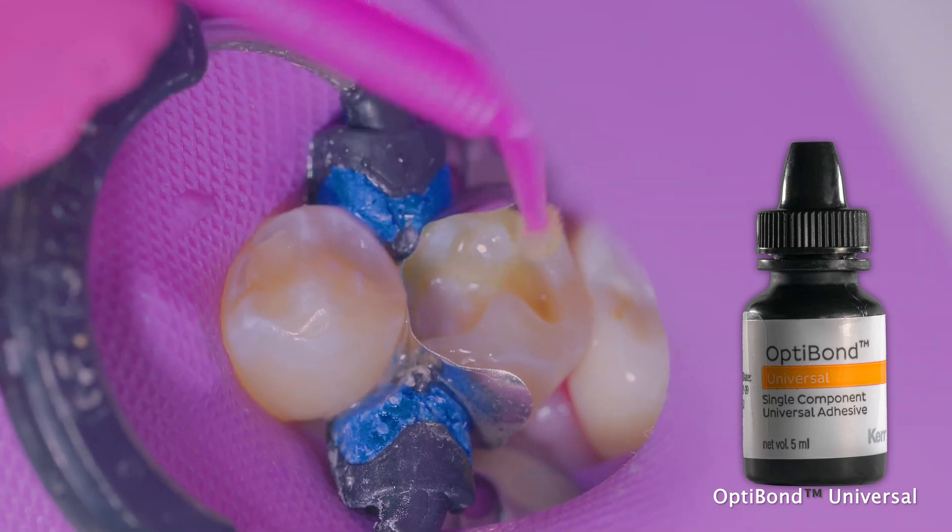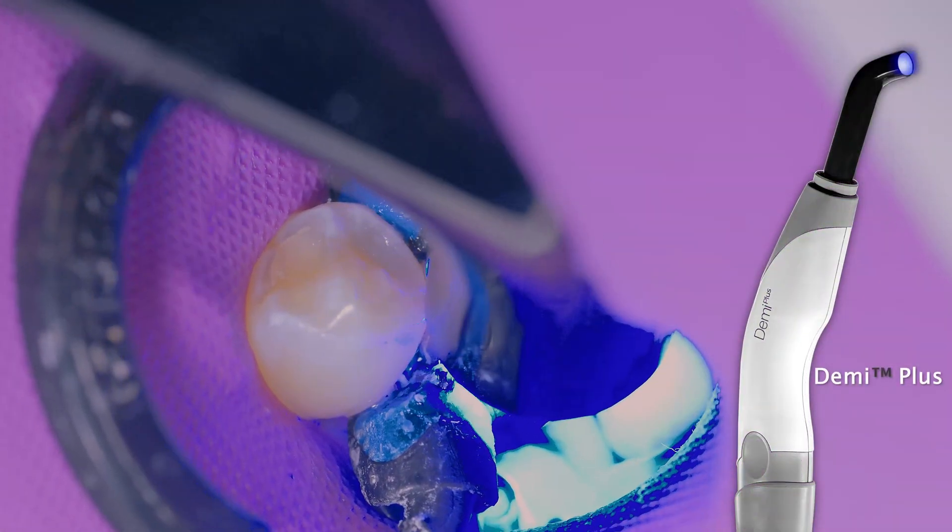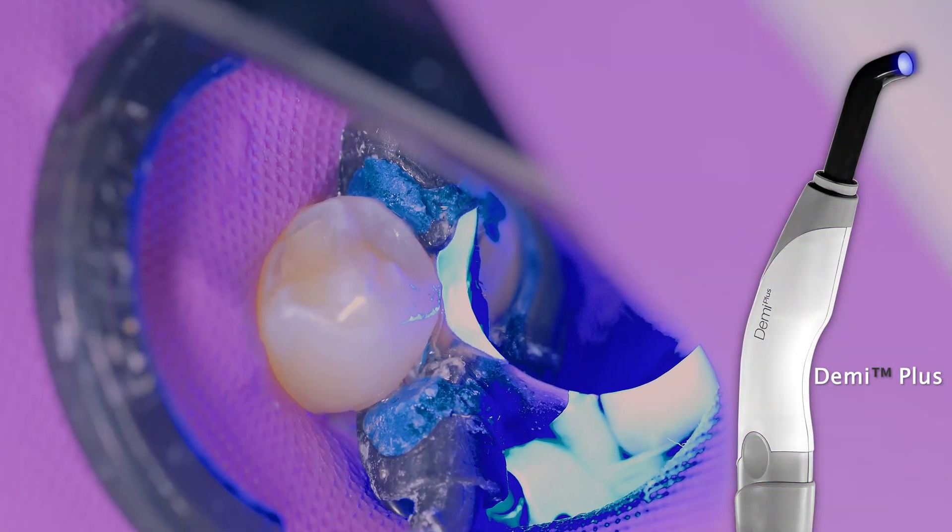I'm applying just one coat and scrubbing for 20 seconds on both the enamel and dentin surfaces, air drying it and following it with a light cure.